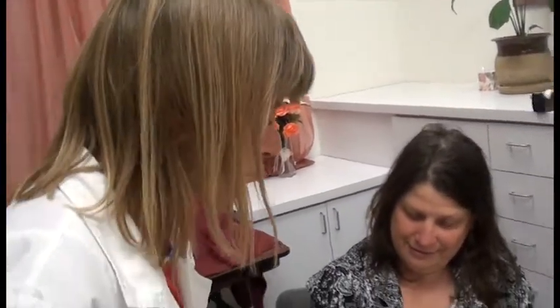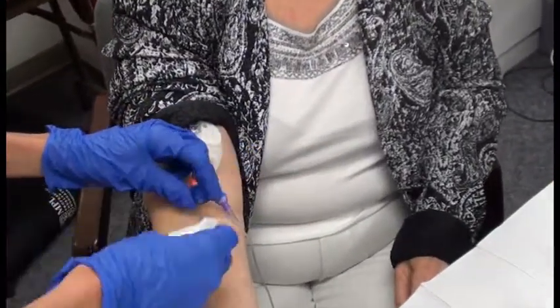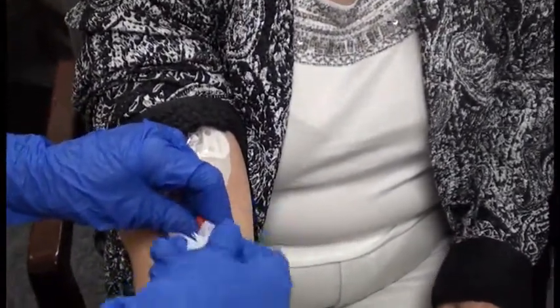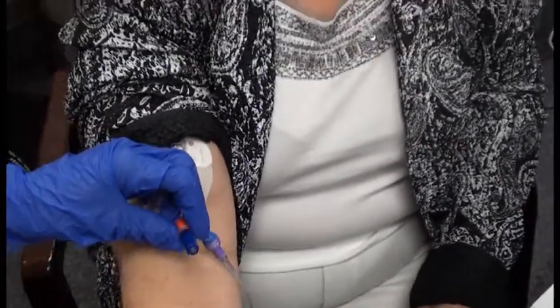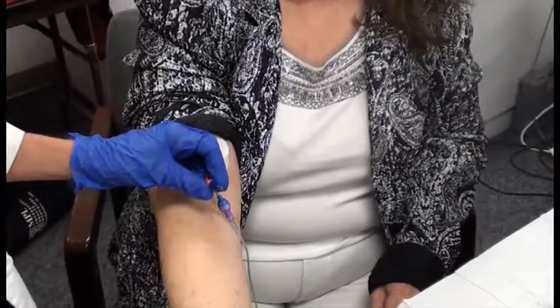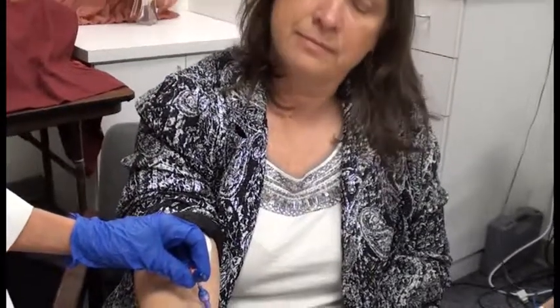Okay, so we're getting ready to draw labs. So I want to identify this port. It's the red one for lab draws. I want to take a juicy alcohol prep pad and cleanse that line at least 5 times. Make sure it dries completely, because the quote from Kurt's sheet on how to mix meds is, the antiseptic qualities of alcohol only occur upon drying.